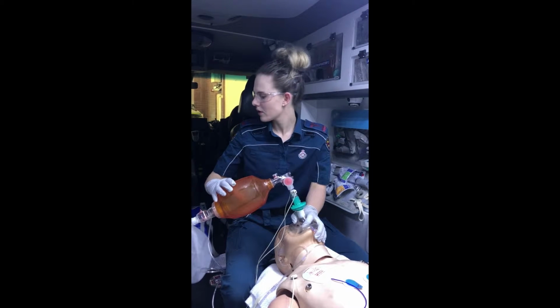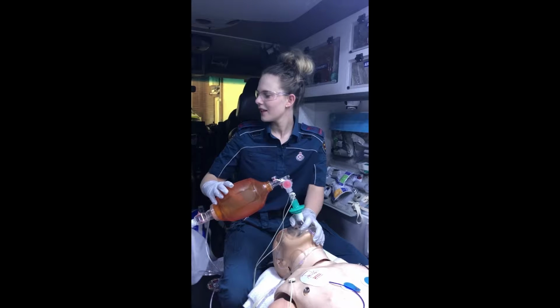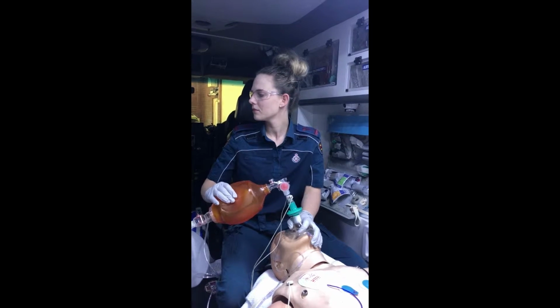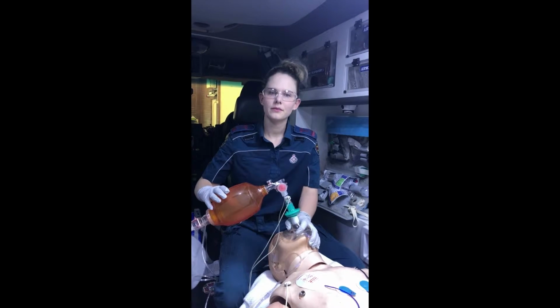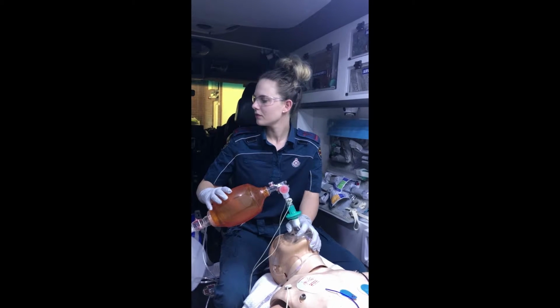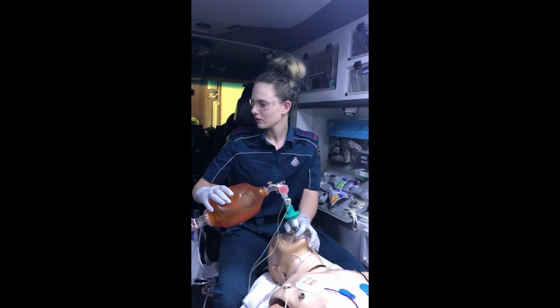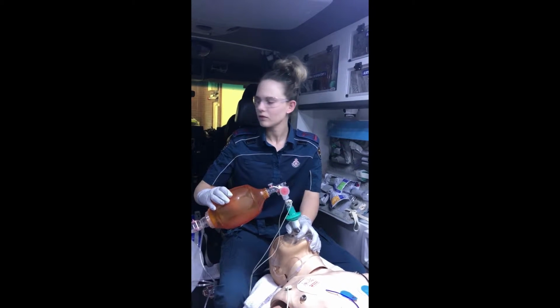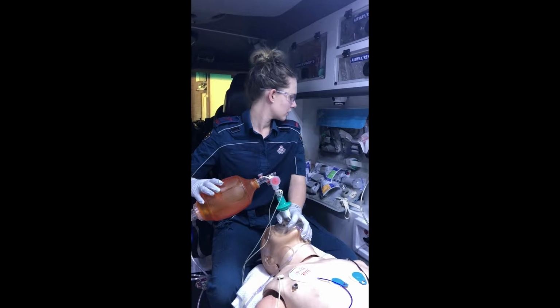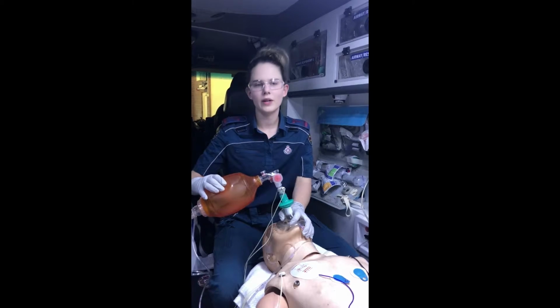Is the following equipment available and checked? Two laryngoscopes? Check. A video laryngoscope? Yes. An ETT? Yes. A spare ETT? It is, and it's one size smaller. And are both cuffs checked? They have been checked. Is there a bougie? There is. Is there a stylet? There is. Is there a 10 ml syringe? Check. A tube tie? Check. A manometer? Yes. An OPA? Yes. Two NPAs? Yes. An LMA available? They are available. And is there a surgical airway available? The surgical kit is available.